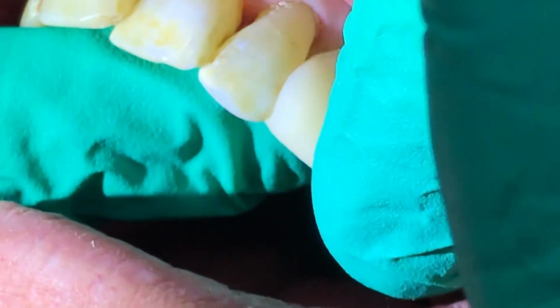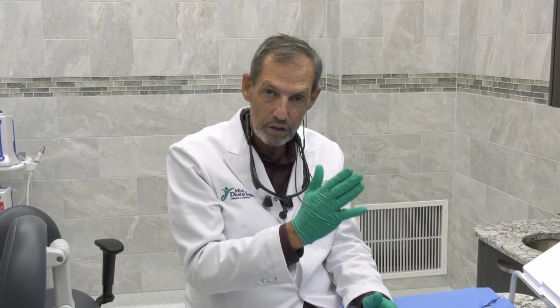When the patient returns, you can do one of two things. You can either cut the temporary in half and pop it off, just like you would a regular crown, or you can remove it by just getting the spoon excavator up underneath the margin and popping it right off. Comes off very easily. That way the abutment is exposed and you're able to go ahead and place your permanent crown.